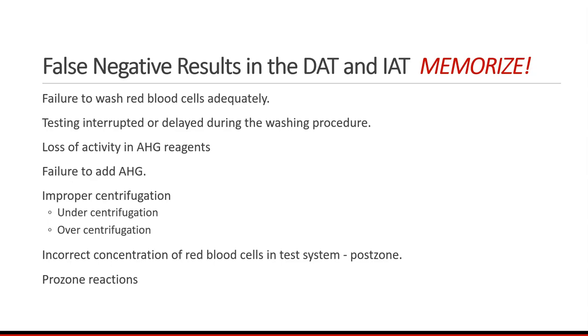You never put droppers on the counter. If you remove a dropper from a vial, as soon as you're done with it, you put it back. 1 drop of a 1 to 1,000 dilution of human serum can inactivate an entire bottle of Coombs reagent. So if you have serum on your hands and you accidentally touch the dropper to that serum, again, the bottle can be inactivated.